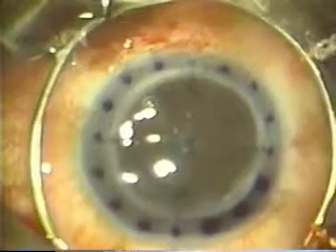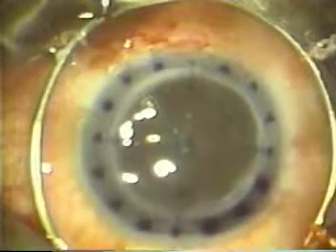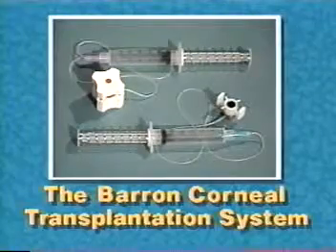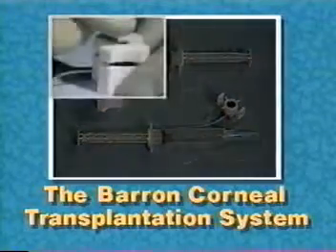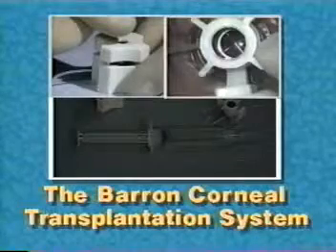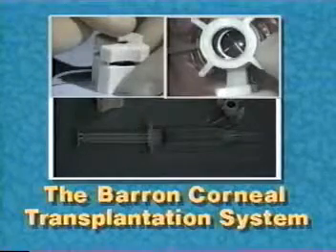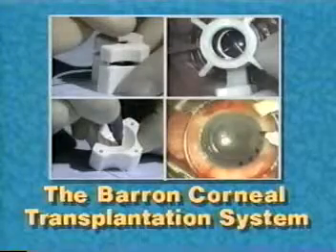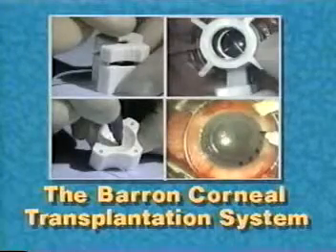The remaining radial marks on the recipient cornea can be used for additional suture placement. The Barron transplantation system is the only system that stabilizes both the donor and recipient corneas as they are cut, contains crosshairs for centration, and marks the donor and recipient corneas for even tissue distribution and suture placement. Steps toward achieving a perfect transplant.